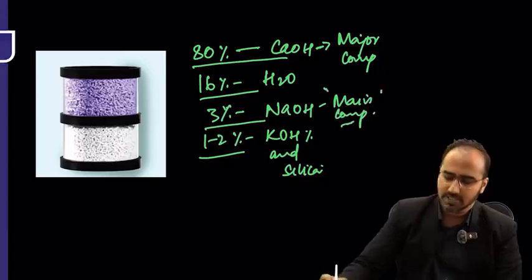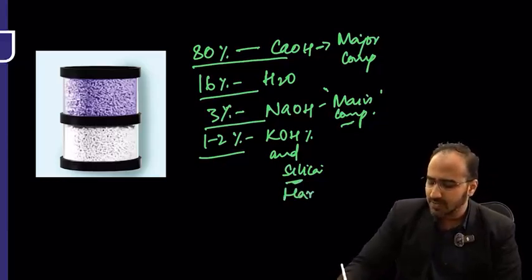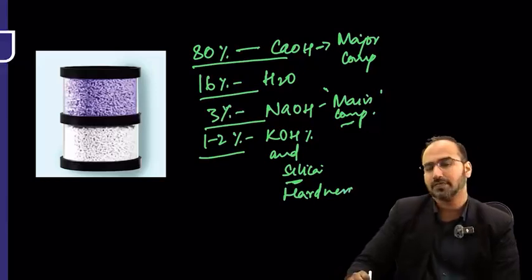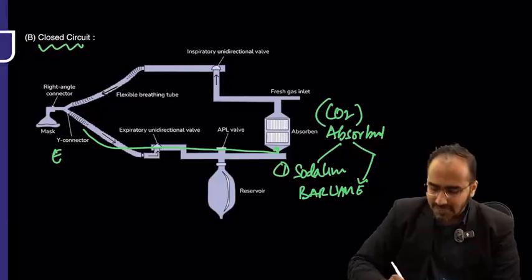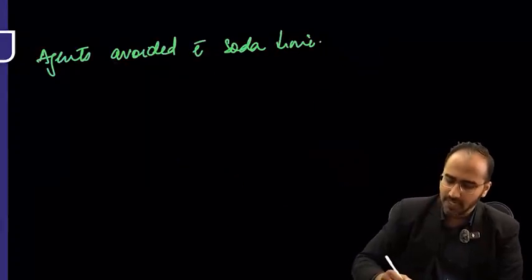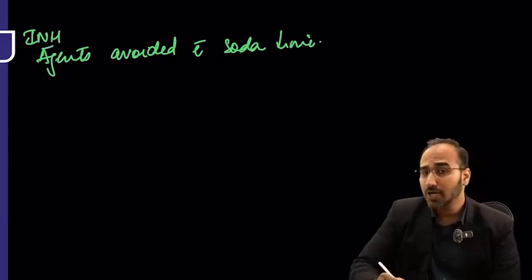Sodium hydroxide. Silica is added to increase the hardness of the granule. Guys, remember, whenever you are using a closed circuit, some inhalational agents have to be avoided. Why? Because they react with soda lime.